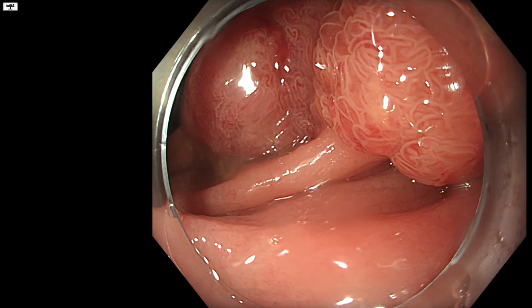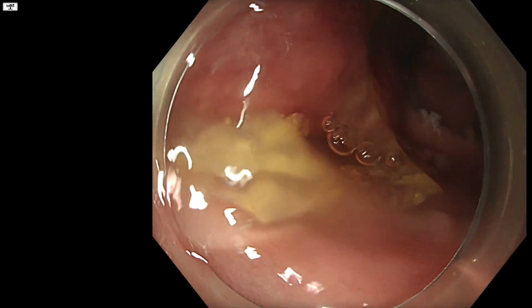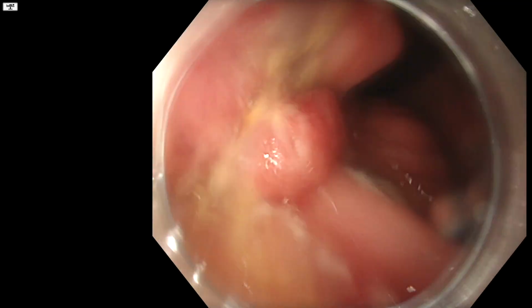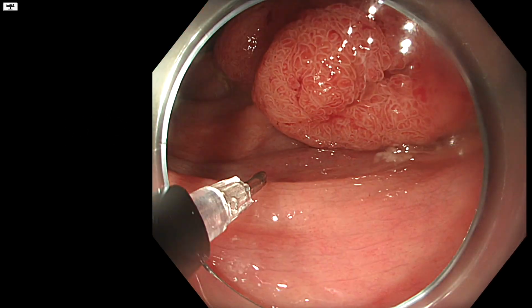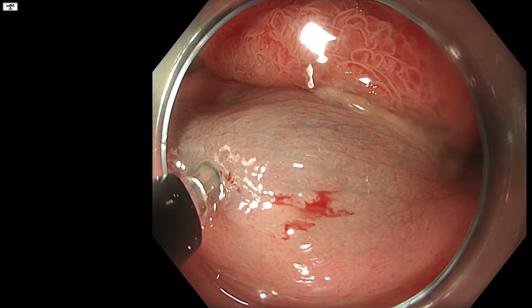So distinguishing a low-risk T1 from a T2 or even a T3 is often impossible until you're well into the submucosa. So I think generally most people are quite cautious when approaching this type of lesion. But we do have to bear in mind that this morphology in the rectum has a high risk of occult cancer, which is why we performed full staging here.